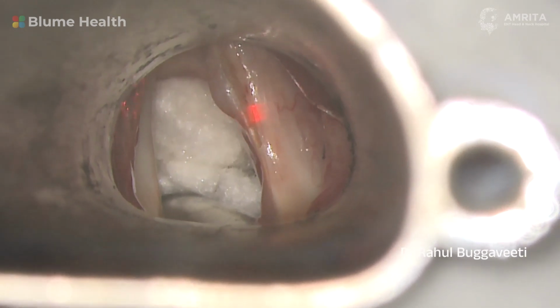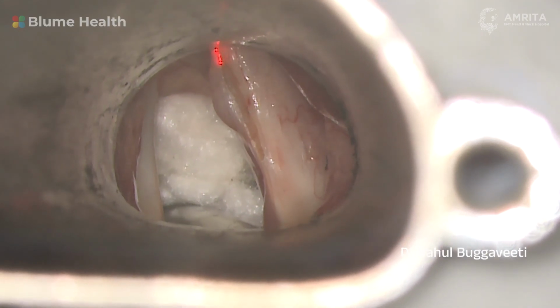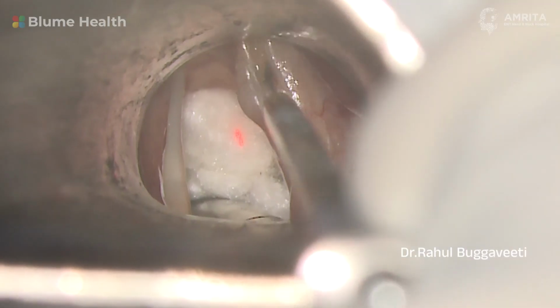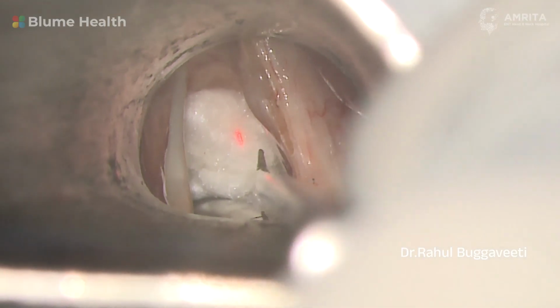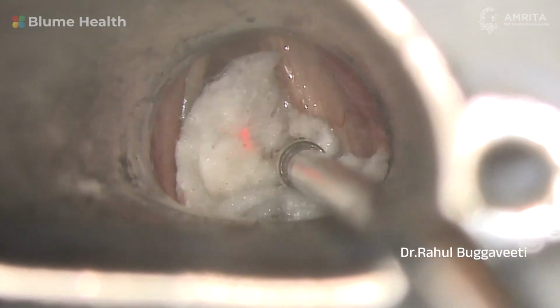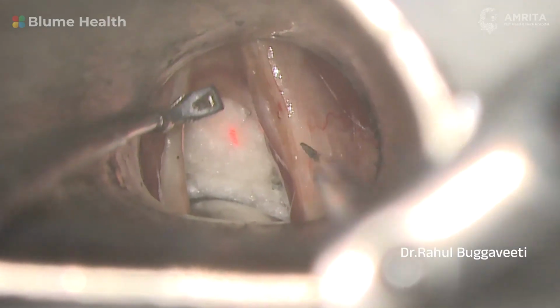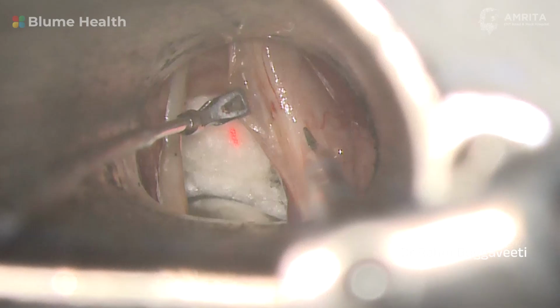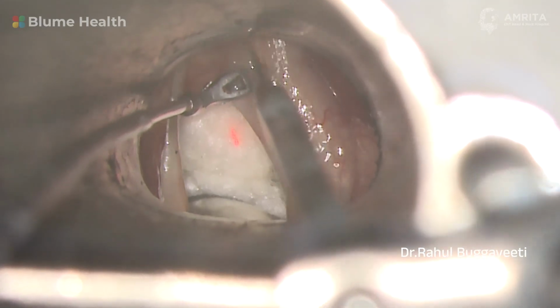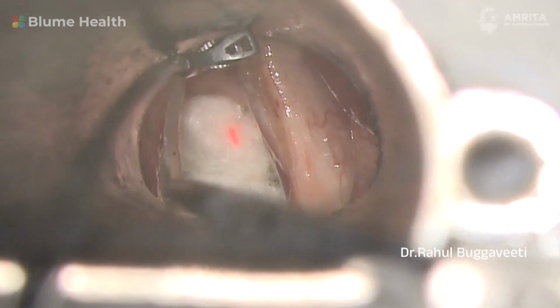Here, now the mucosal cuts are given with CO2 laser. And the cyst is gently separated from the vocal ligament. You can see that the cyst is ruptured and the fluid from the cyst is cleared with the swab. The remaining walls of the cyst should be gently separated from the vocal ligament and from the vocal fold mucosa.